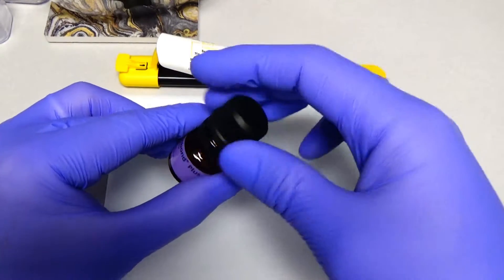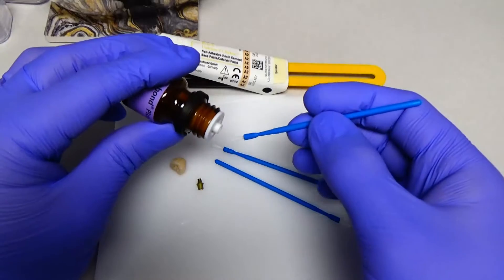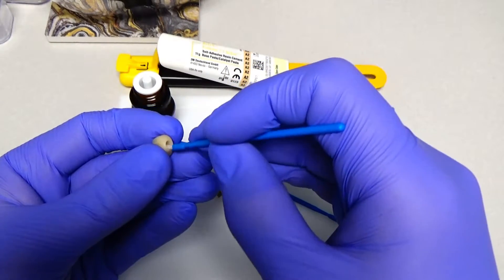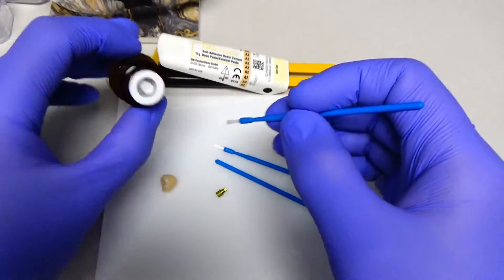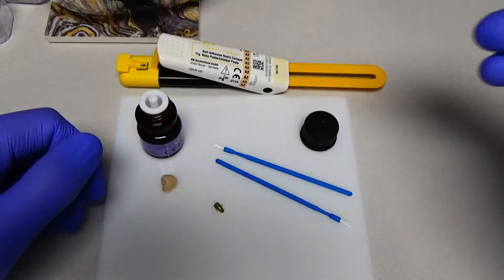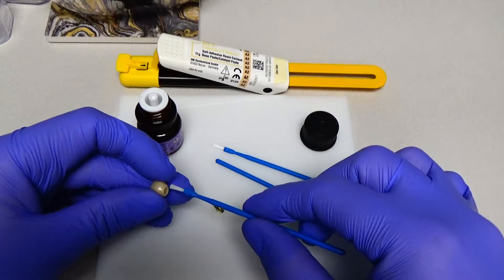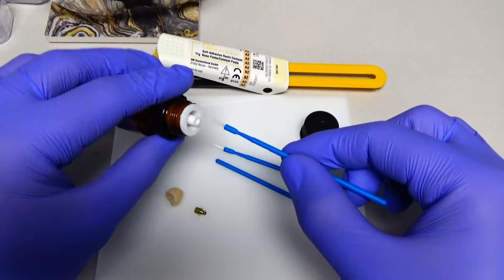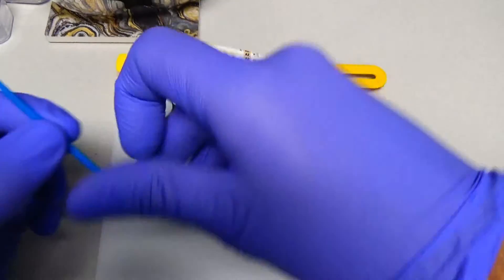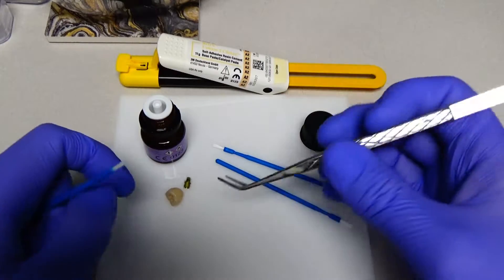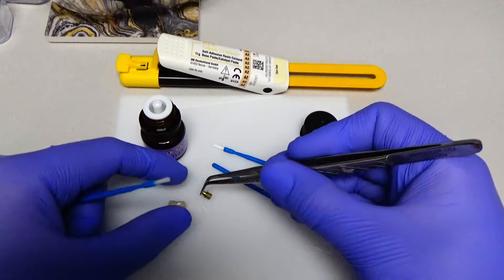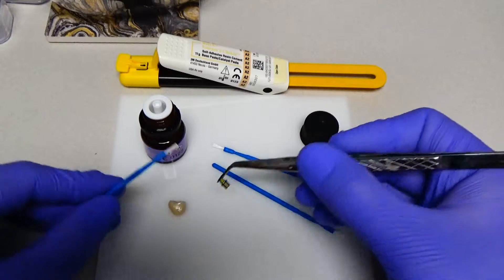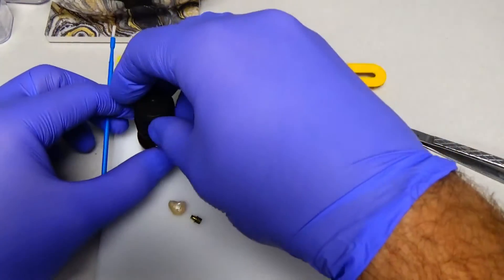So the first thing that we do is apply the Monobond. And the Monobond just needs to go on for 60 seconds to each surface there. And I'm wearing gloves because I don't want to contaminate as little as possible. So I was interrupted just for a moment there, but I just applied the Monobond Plus on the internal surface of the crown. And then now I'm going to apply a little bit more to the surface of the titanium insert here. And this just needs to sit and then we'll dry it off here in about 60 seconds.